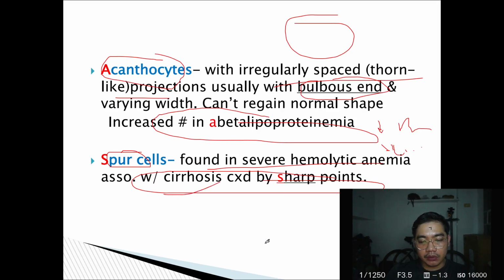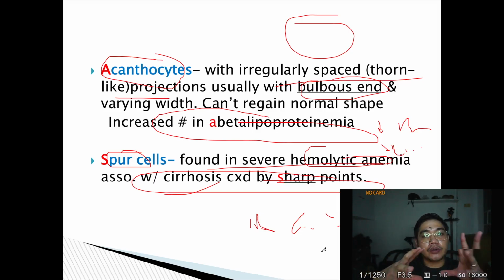So what happens with cirrhosis? Your plasma proteins have gone bonkers, no? And with hemolytic anemia, cells with little content, as in iron deficiency anemia, become hypochromic. If they have no content, then you can form them any way you could, no? Same example as the balloon.